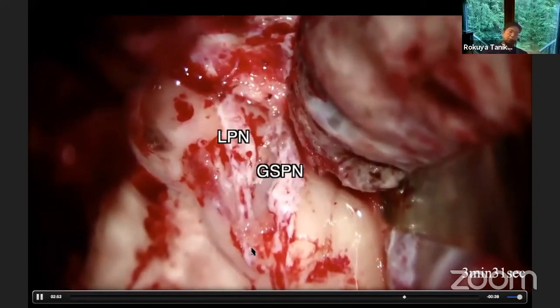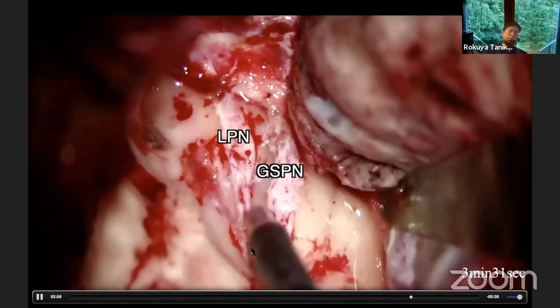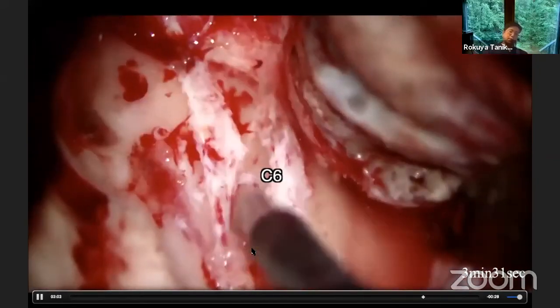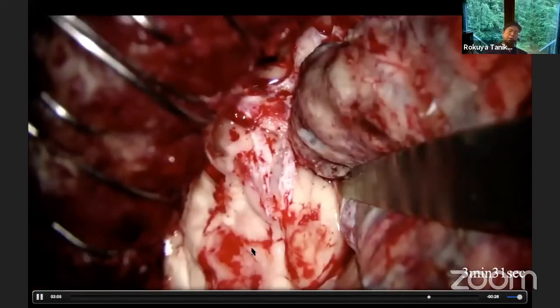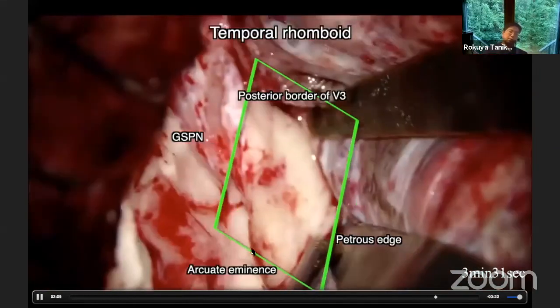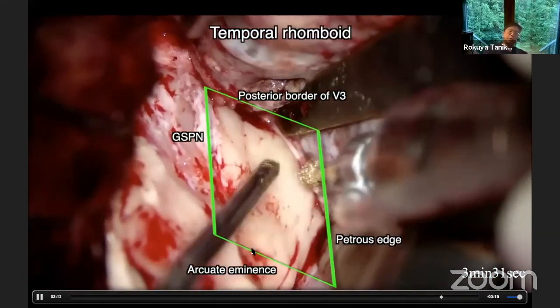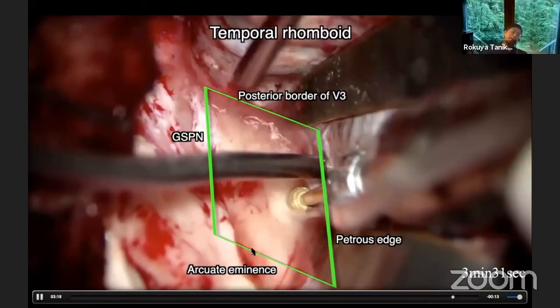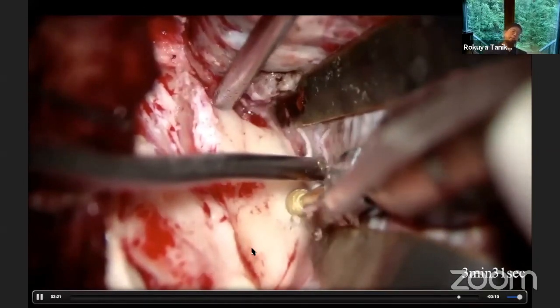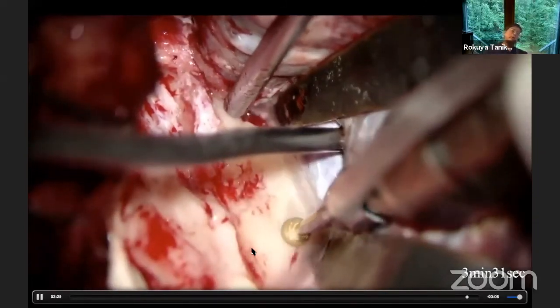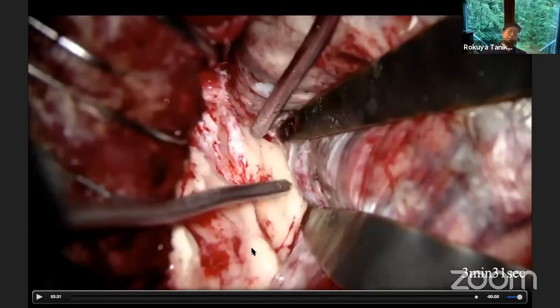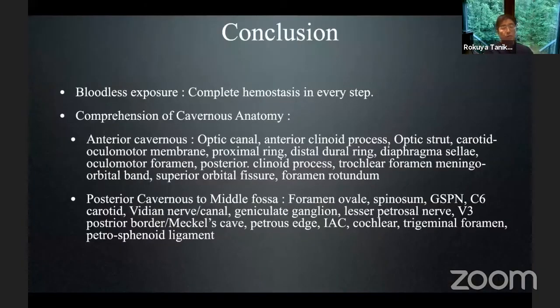We can recognize the temporal rhomboid after elevation of the middle fossa dura. Between the lesser petrosal nerve and the GSPN, you can find the petrous carotid covered by very thin bone. The temporal rhomboid is defined by the posterior border of V3 and GSPN, and these landmarks must frame the temporal rhomboid. The anteromedial corner can be the top point of temporal rhomboid drilling. Because just under the GSPN there is the C6 internal carotid, we must be careful not to injure the C6 carotid during temporal rhomboid drilling.